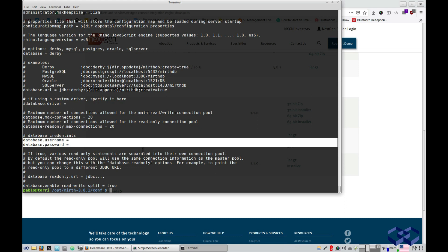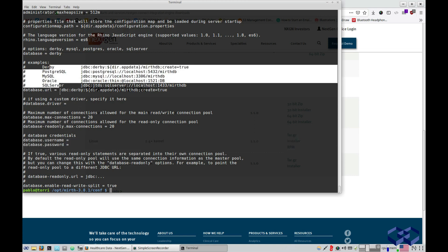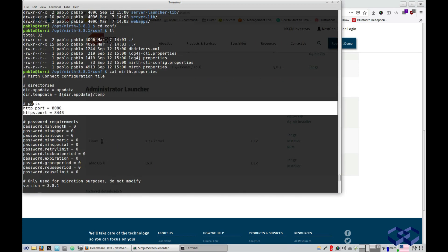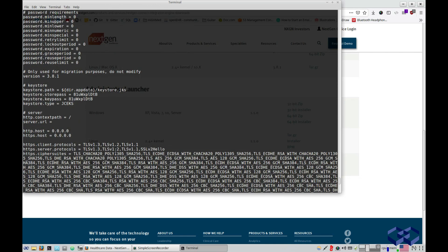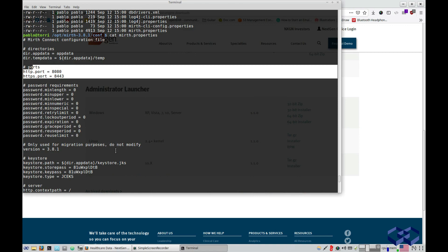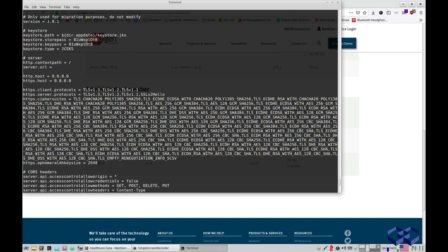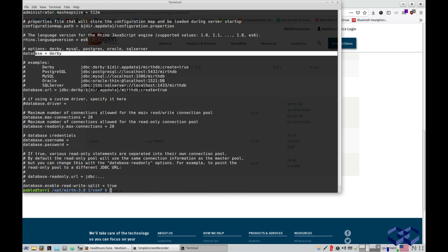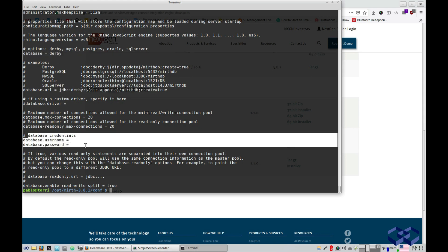The installer actually guides you through the process of installing and configuring MIRTH Connect, asking about the database you want to use, the user and password, and the ports. But you can also just download, extract the files, and change them manually in mirth.properties. You only need to specify which database to use, the connection string, and the user and password — nothing else is required.